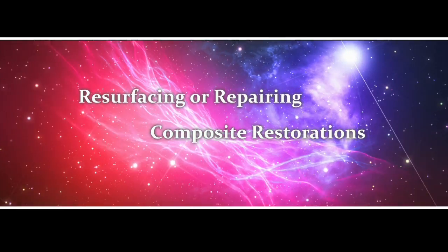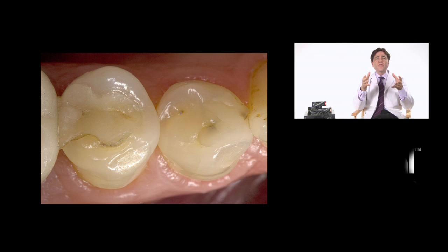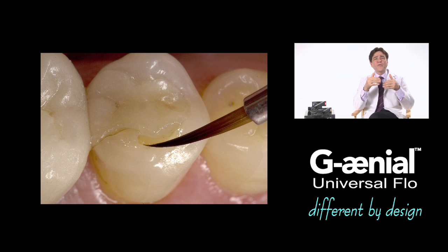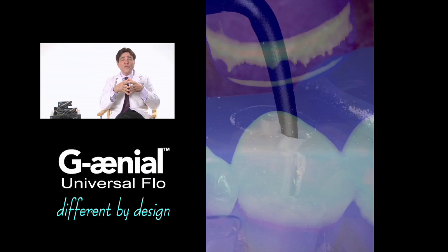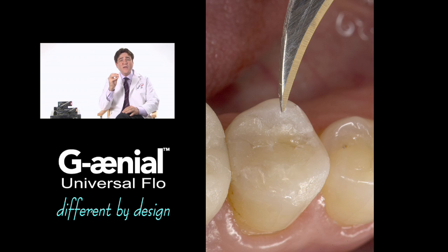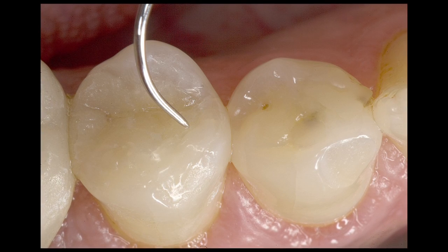To resurface or repair composite restorations. Repeated flexural forces can also cause adhesive failure of adhesive restorations at the dentin-resin interface, which can result in microleakage and partial or complete debonding of the restoration. A simple indirect-direct technique can be used to restore anatomical morphology from wear or fracture using these next-generation flowable materials.